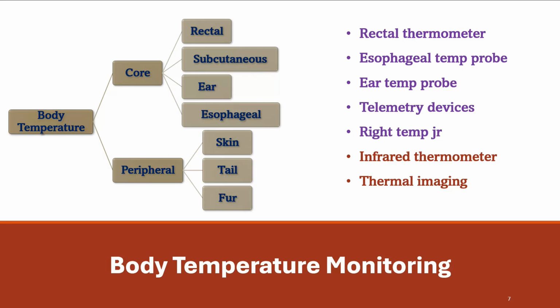Another important feature when we monitor the core body temperature using products like RightTemp Jr. or PhysioSuite is that they have the added advantage of working in various modes. For example, there is a pad-only mode, or there is a homeothermic mode wherein, based on the feedback the system receives from the rectal temperature, which is measured on a continuous basis, the intensity of warming can be altered.